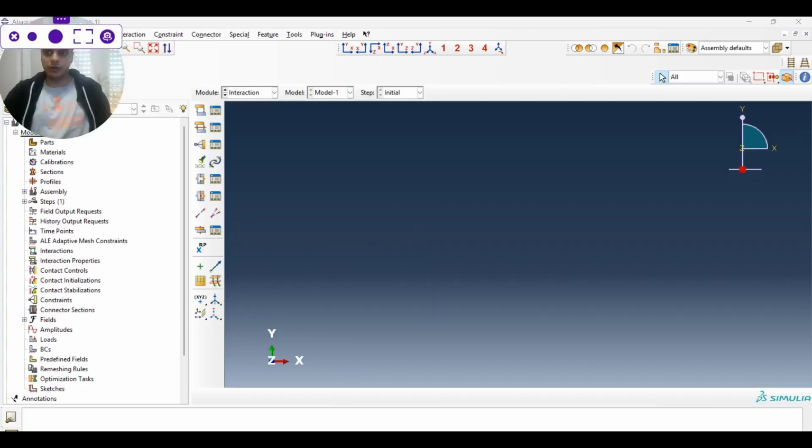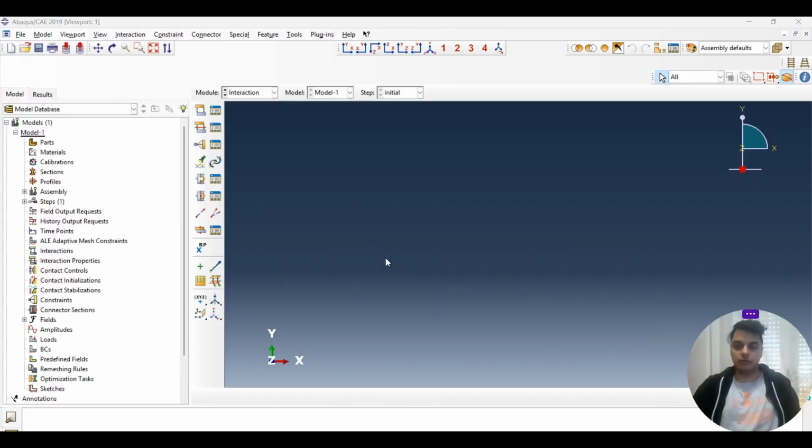The next screen that you will see is going to be the Abaqus screen. We are already familiar with the user interface of Abaqus. Today we will try to learn a bit about different types of materials that we can give, like linear and non-linear materials. For rubber, particularly, we have different types of elastomers that we have to define. Even for soft tissues, we have to use hyperelastic properties. Also, make sure this session mainly consists of the plastic materials as well as the rubber. For metallic, we have already done some part of it for steels, but for polymers, this is what we are doing today.